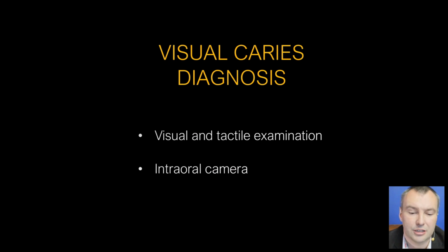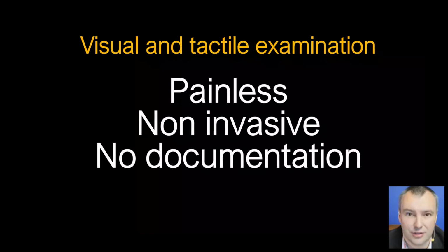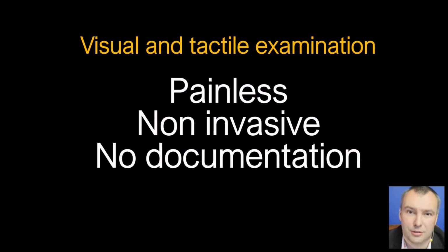With visual diagnosis, we can use our eyes and a dental probe, an examination that we have used every day for probably hundreds of years now. It is for sure painless and non-invasive, although we couldn't say it is comfortable, because we sometimes need to touch the tooth, use some air, maybe some water and so on. We get no documentation out of such an examination.